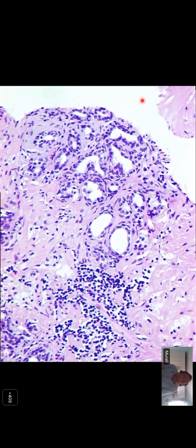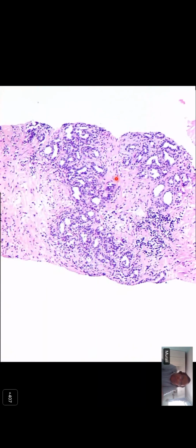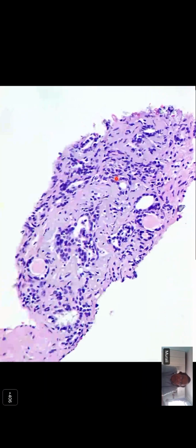There is another type of atrophy, which is called partial atrophy. That looks very pale because it has a lot of cytoplasm, but that is lateral cytoplasm. Again, there is no apical cytoplasm. So in this case, the first thing that should strike you is that it's a very blue proliferation where the nuclei are going to the lumen, and so you have to be thinking about atrophy. This might be benign atrophy, or this could be an atrophic variant of prostate cancer. So you have prostate cancer which looks atrophic.